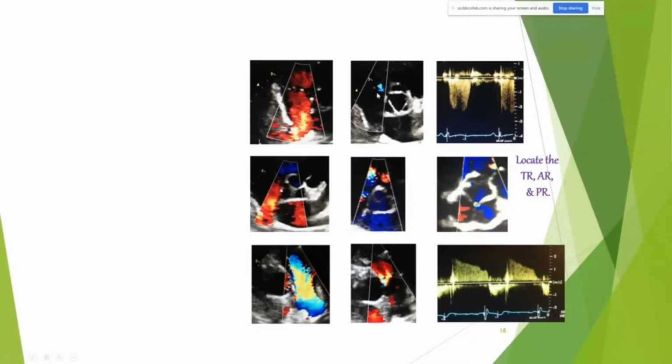Where? Right here. I lost your cursor. Oh, that's the right atrium. So what's going on there, though? Regurgitation. Of what? Tricuspid insufficiency or tricuspid regurgitation. Yes. Thank you.